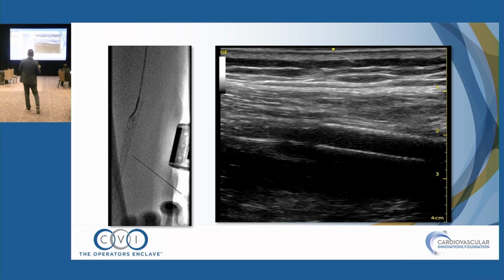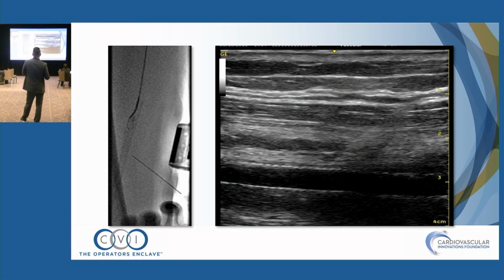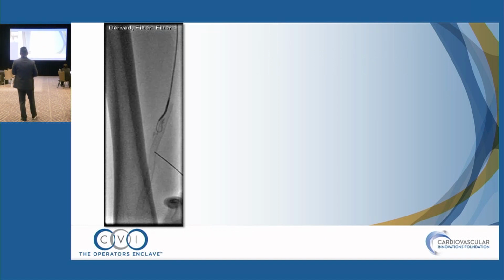Your angle of approach may end up being a lot more acute than you realize. But this is what it looks like. This is the needle. You can barely see, but the needle is here coming in. You can see here as the needle punctures, you're through. You can tell by ultrasound.